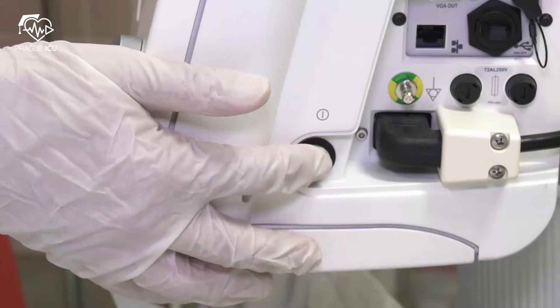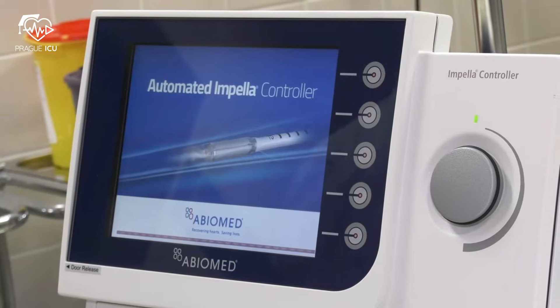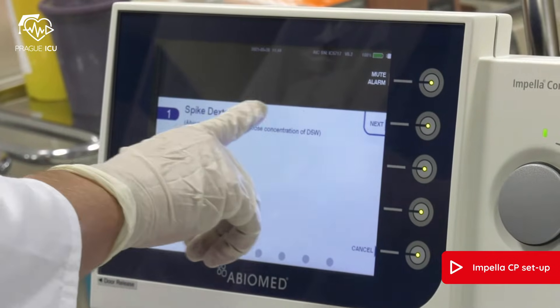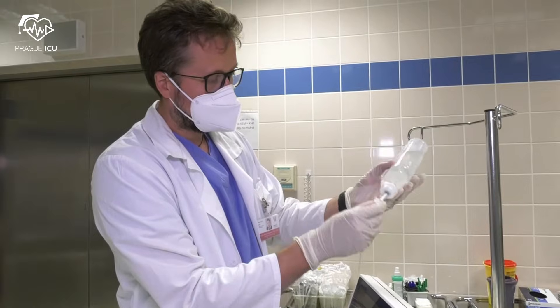First of all, turn on the Impella controller by pushing the power button on the right side for three seconds. The controller is starting to the start-up screen. At the start-up screen, press the button 'Start Next Case' and follow instructions.